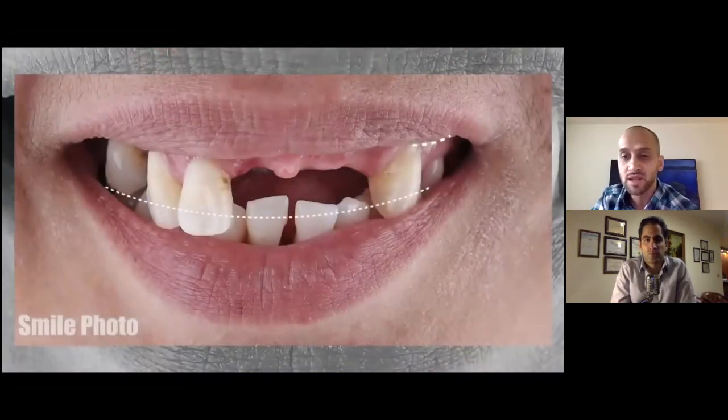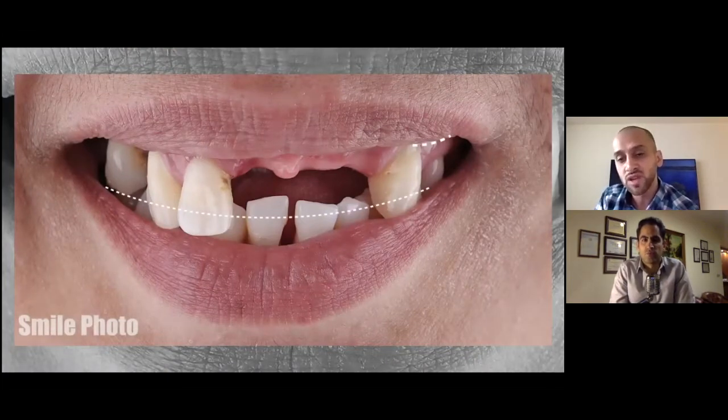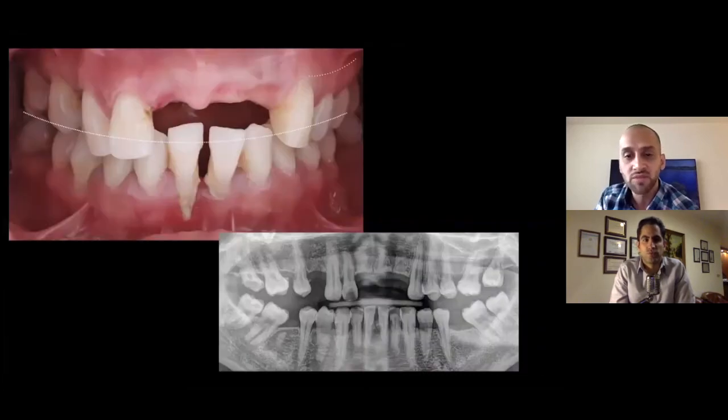You can see on the patient's upper left side, there's some crown thinning that needs to be done. I'm just going to go through this case very quickly to show you how screw retention can really give us some really beautiful results. And as you can see, the incisal edge needs to be reduced, and by that same amount, crown lengthening has to be done to move that gingival margin superior.